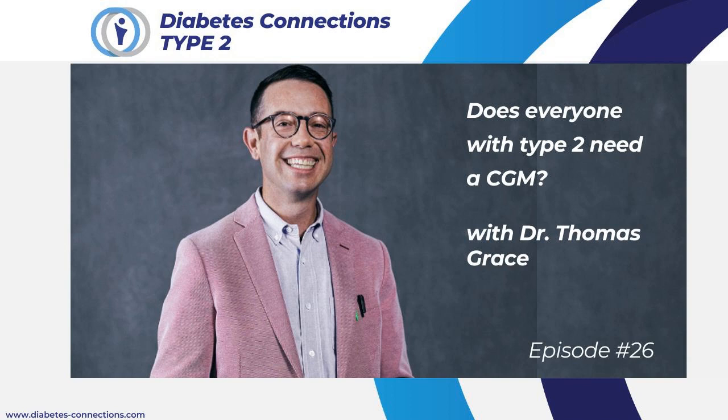So this week, we're going to talk about GMI or EA1C. These are two terms for what's basically the same thing. It's the estimated A1C that you get when you use a CGM. We defined A1C in the very first episode. That test measures your blood sugar levels over the past 3 months. This test specifically gauges the amount of blood sugar, blood glucose, that's attached to the hemoglobin in your red blood cells. It's 3 months because that's the average lifespan of a red blood cell.